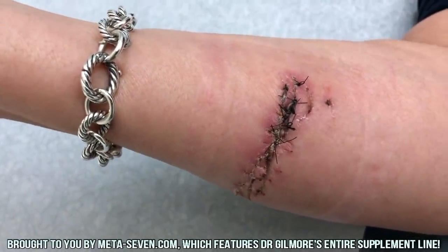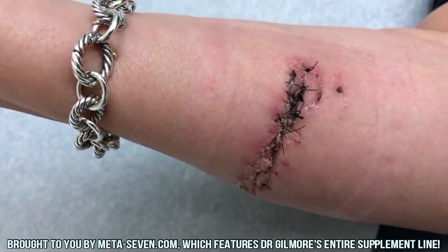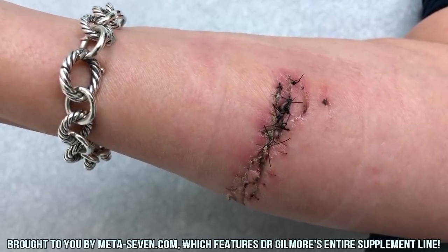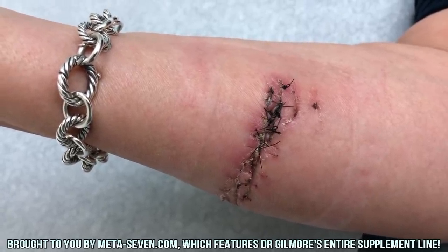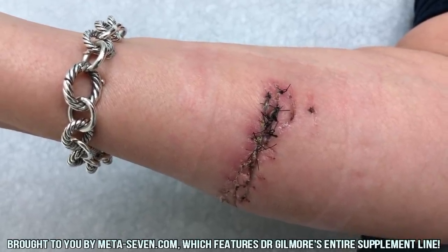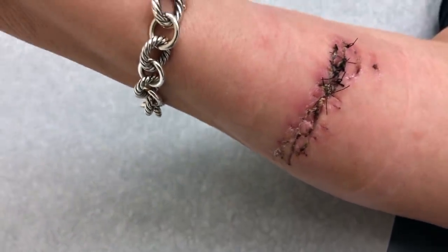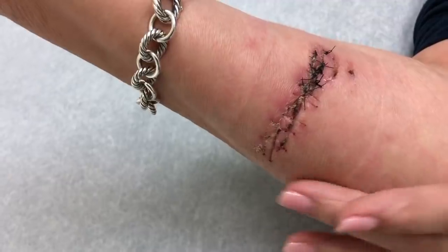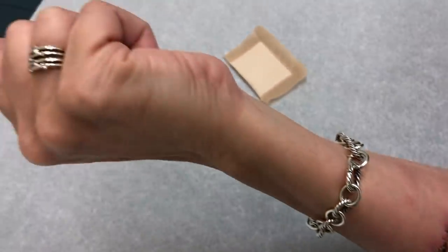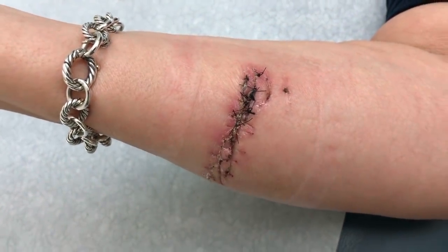We're going to have to — you've got some scab in there — that's going to make the suture removal a little more complicated. We don't want you to bleed or hurt, so we're going to soak it with a little saline and then remove the sutures. The moral of the story is you can move your fingers. Oh yeah — thank goodness I did not hit any tendons or any muscle.